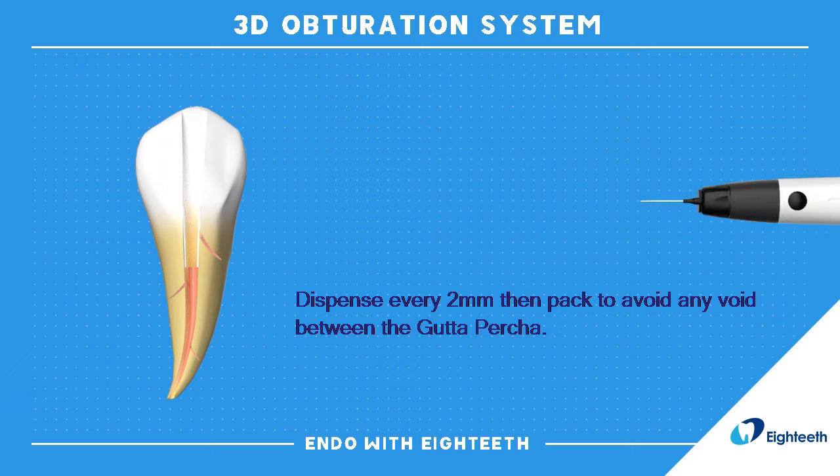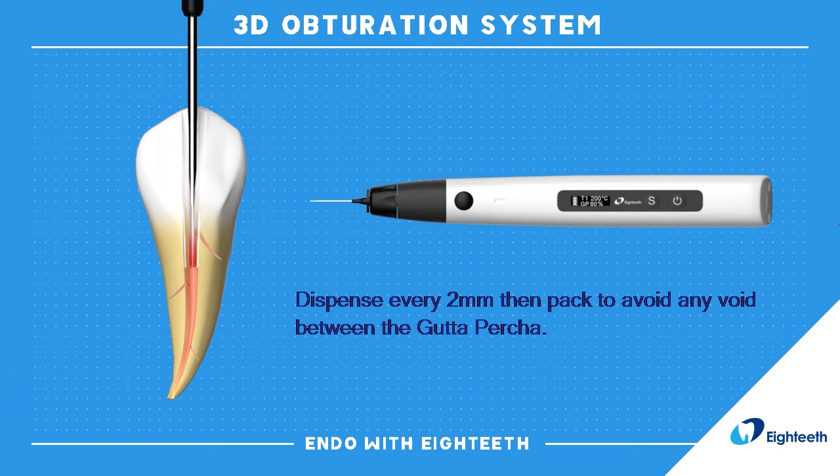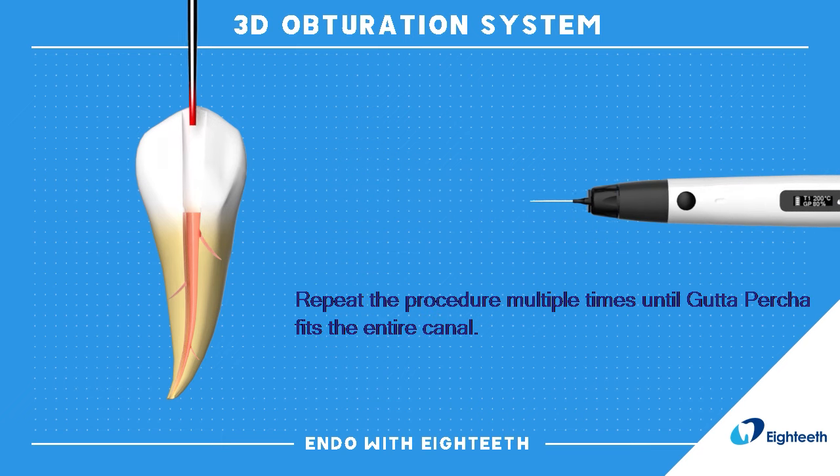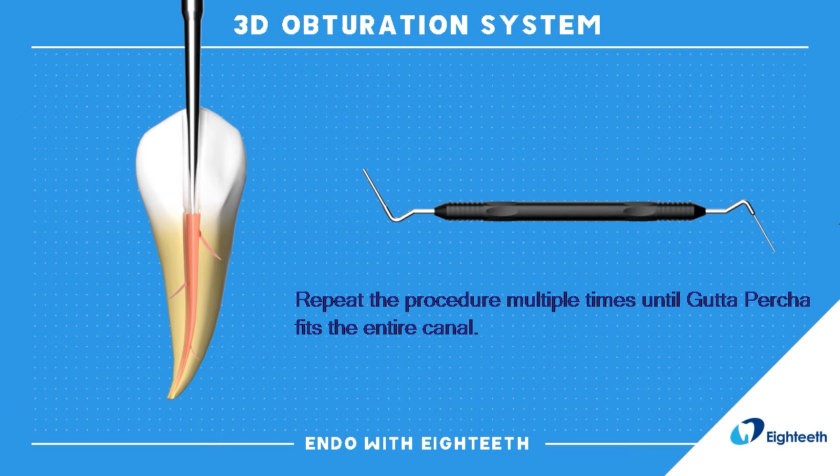Dispense every 2 mm then pack to avoid any void between the gutta percha. Repeat the procedure multiple times until gutta percha fills the entire canal.